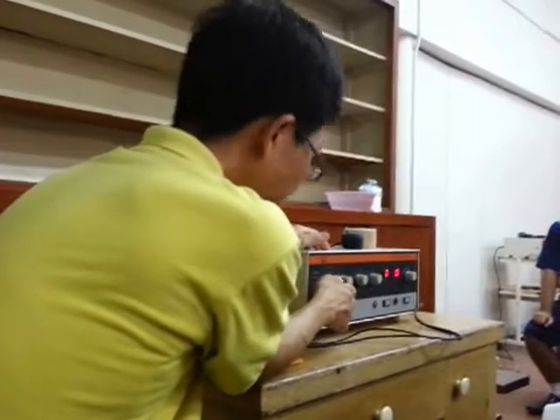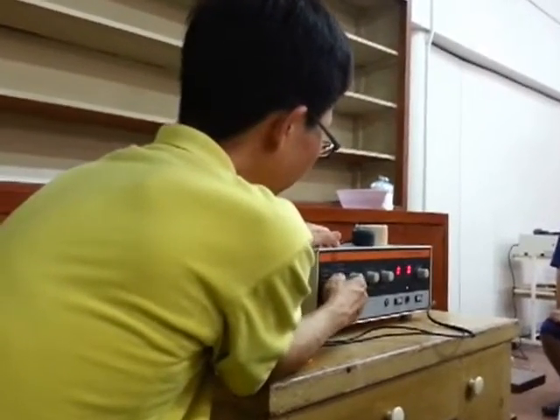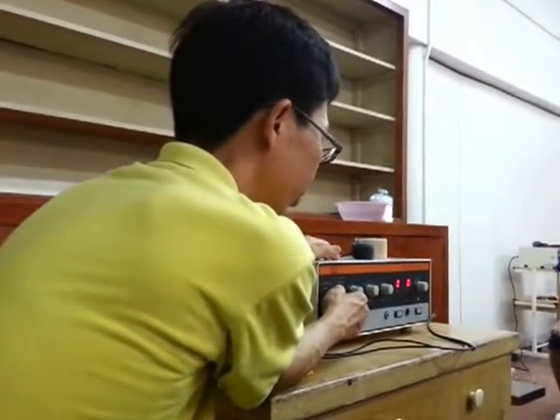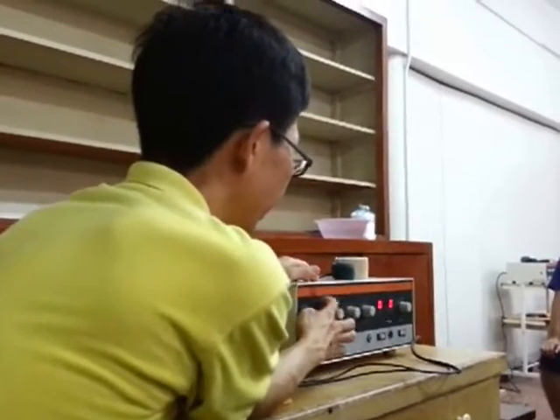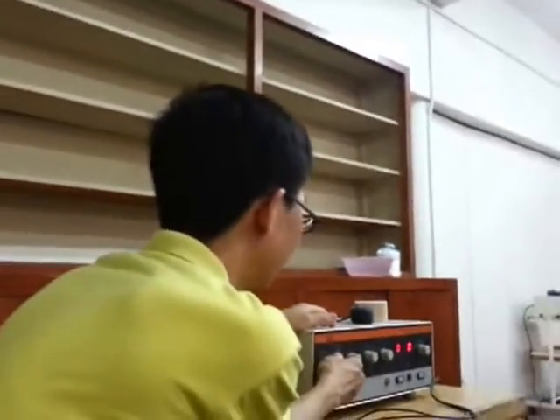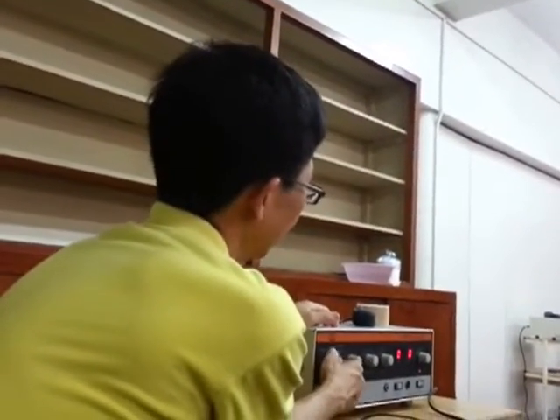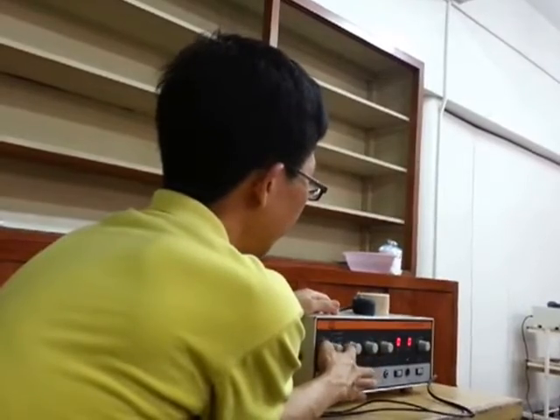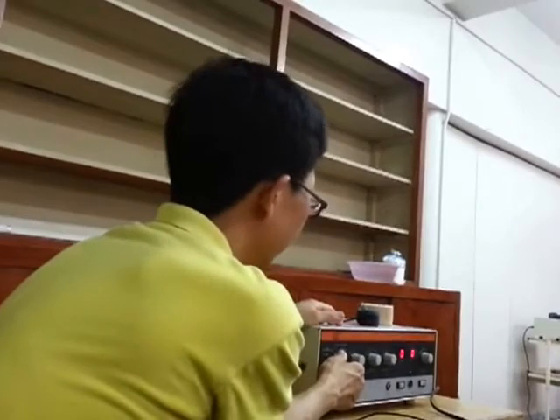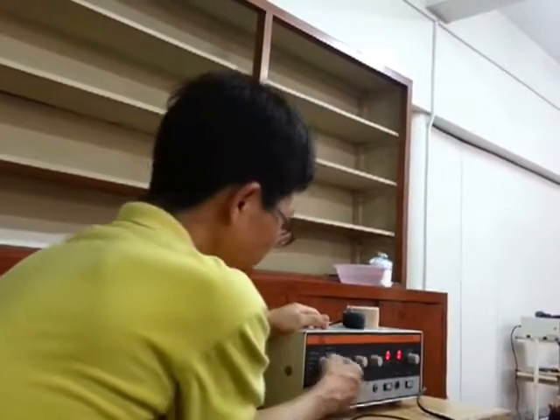So here, if surge, you're going to place it here. If you're not using surge, you're going to use either these two, rectangular or triangular. So surge here again, there's gradual increase and decrease of the intensity. Then if ever you're not going to use surge, you can use either these two.